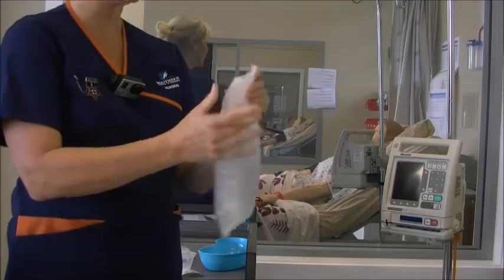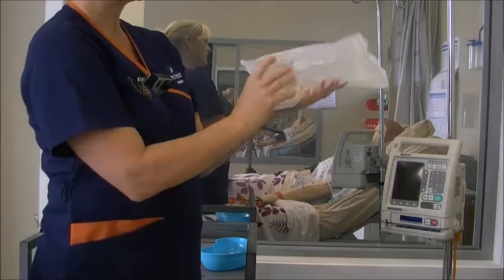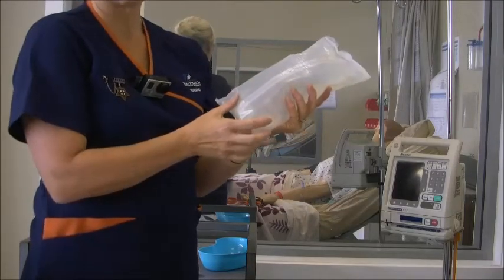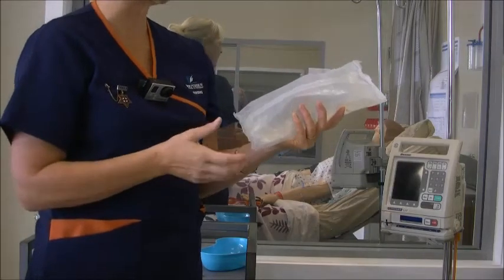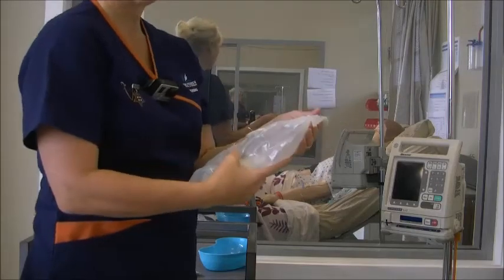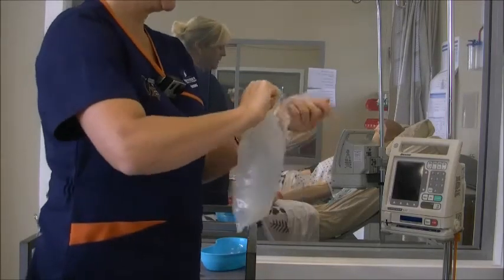So I'm going to, firstly when I get the bag, look at it to make sure that it's complete. Sometimes when you get an IV bag that has a little bit of condensation in the bag, that's a good thing. So it means to me that the bag is quite fresh, and so I'd always check that prior to putting it up.